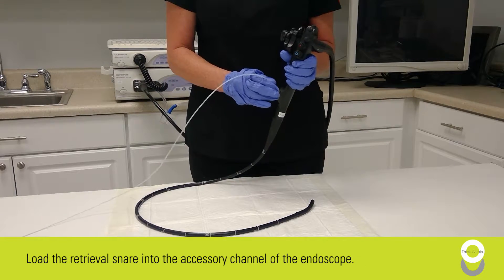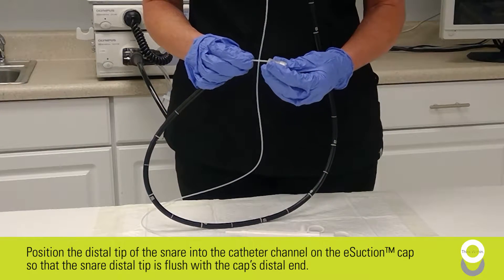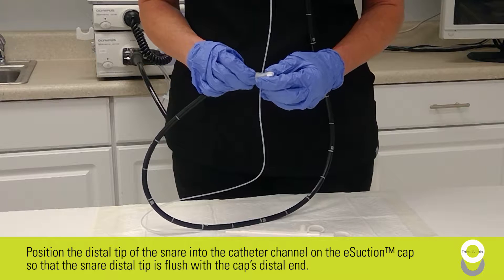Load the retrieval snare into the accessory channel of the endoscope. Position the distal tip of the snare into the catheter channel on the eSuction cap. The tip of the snare should be flushed to the end of the cap.